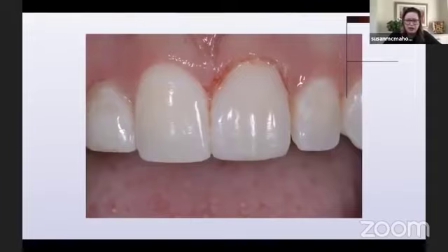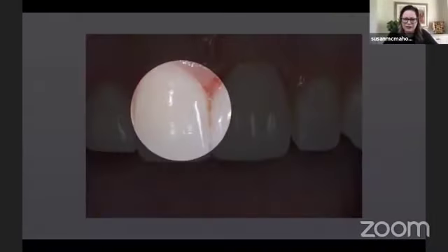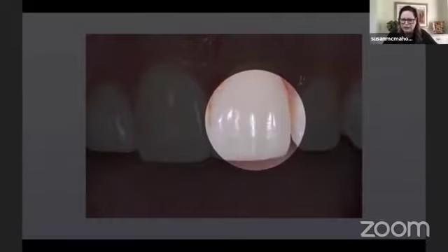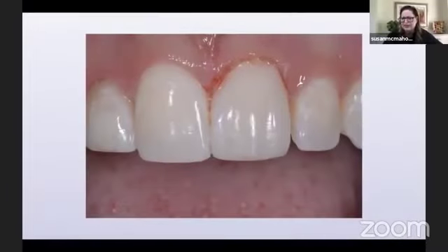And this is what it looks like. So composite, disking for the line angles, coarse diamond, two polishers. All of that is less than 10 minutes. And this is the natural tooth next door. And you see how it has that surface texture on it, has all those sort of lines, and you're able to mimic that in composite. So the polishers will polish the composite surface, but because you use that coarse diamond and because you spun it slow, it will still leave some of that surface texture in there.